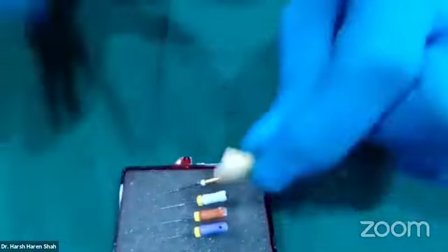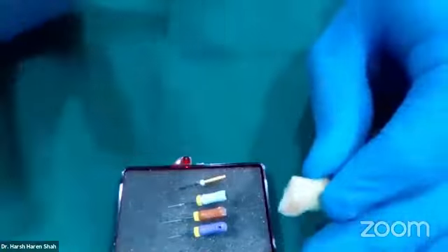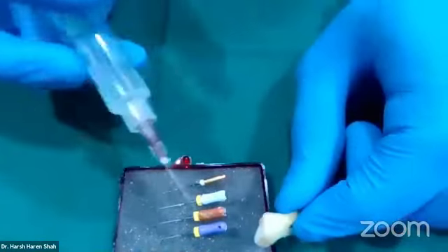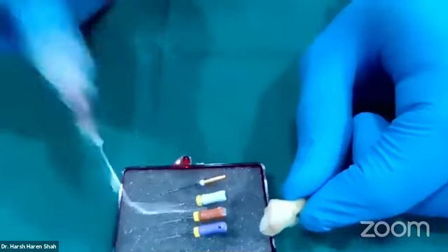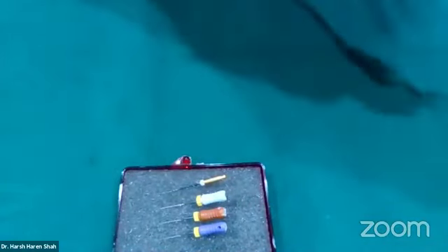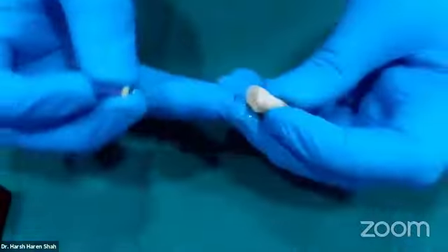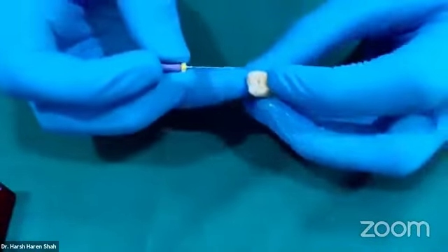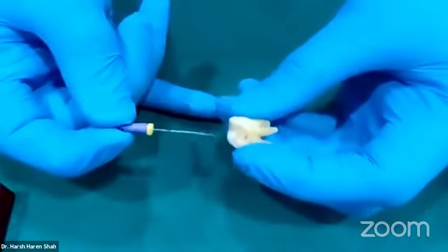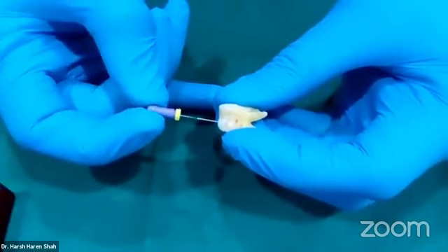Now what you do is you will never be working in a dry canal. So I will first be irrigating one canal. In these 3 canals, I will be showing you 3 different methods of glide path preparation. So I'll just irrigate this. I will take my 10 number K file. Let me take the distobuccal canal, for example, in this case. I will introduce the 10 number K file inside the canal.